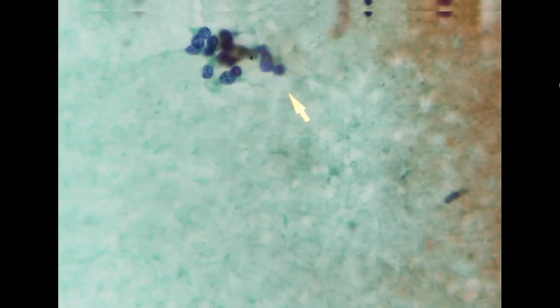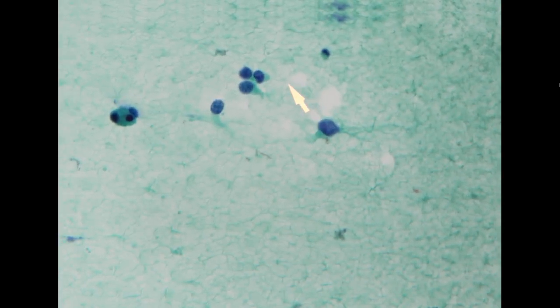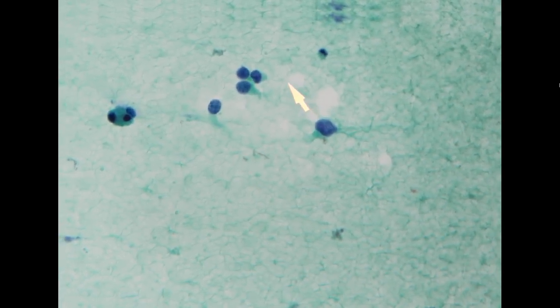This is her very first diagnostic specimen in our hospital. So this is consistent with metastatic breast cancer, and the patient needs additional stains to find the primary tumor. But just based on the morphology, our first guess is also the breast.